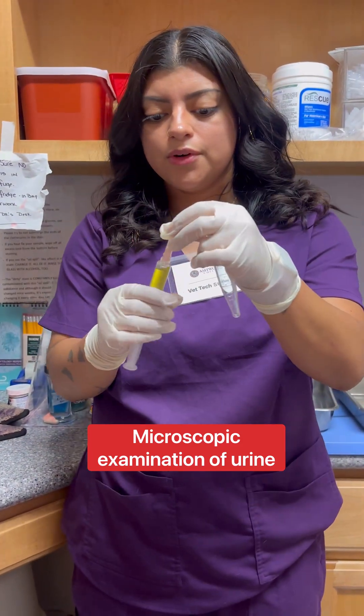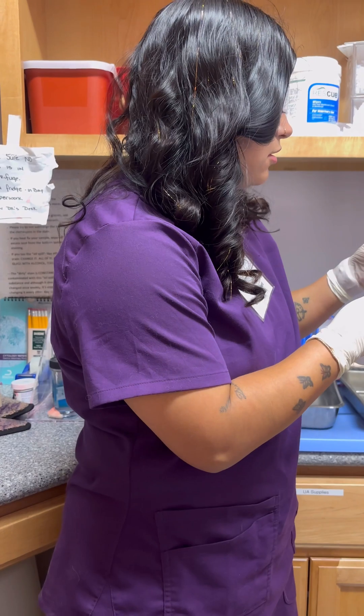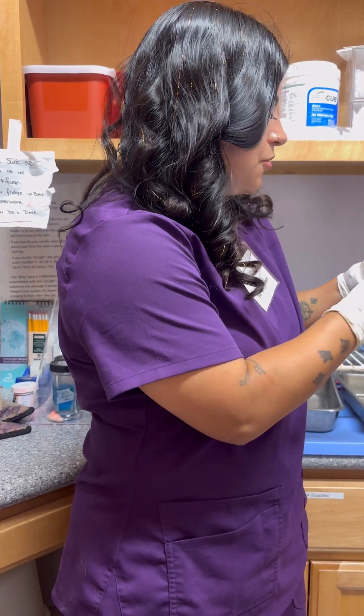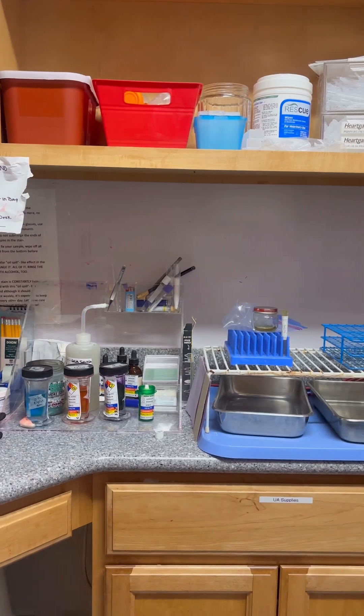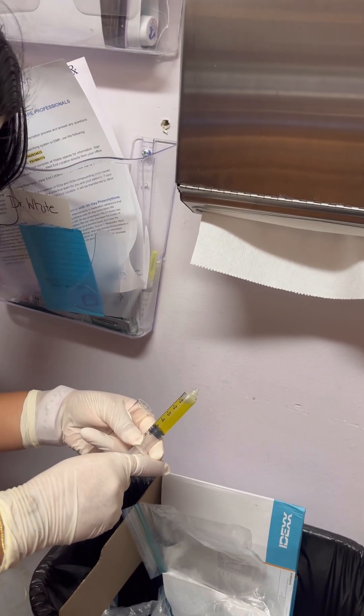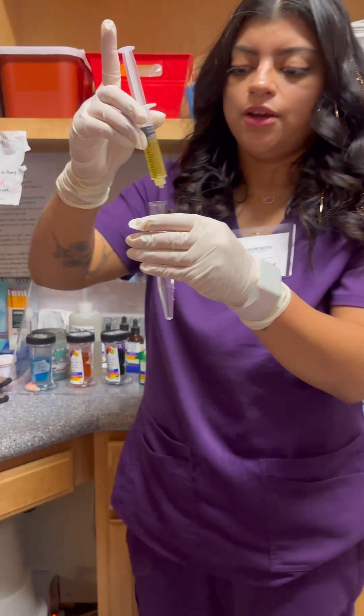I have my urine sample. With this one, I only need 5 ml, so I'm going to get rid of the rest. I'm going to pour my urine into here.